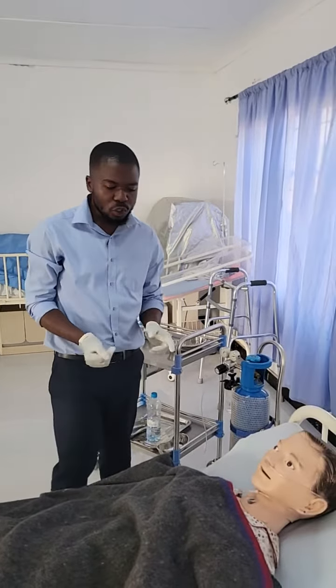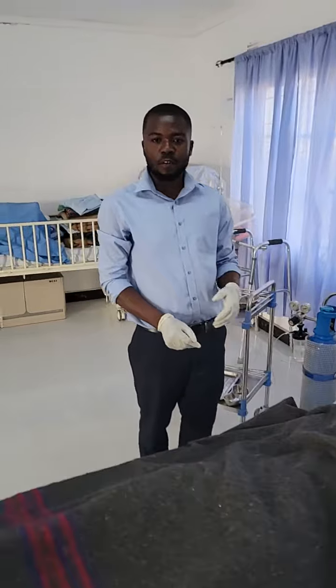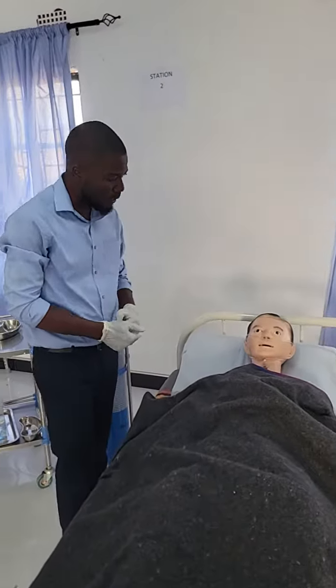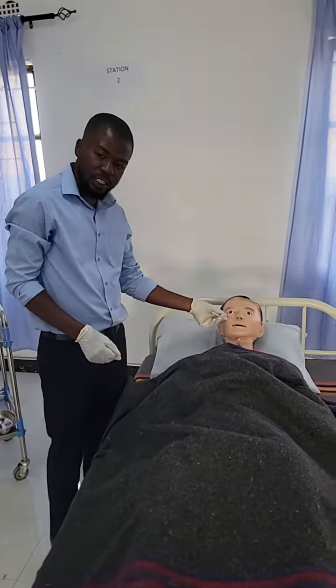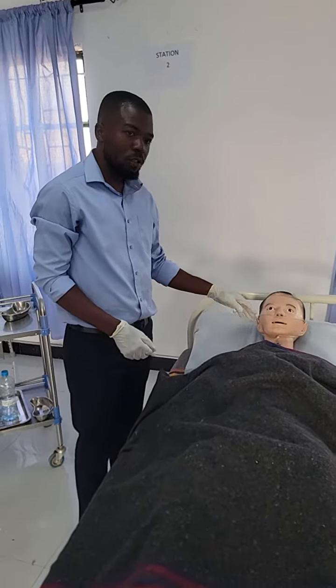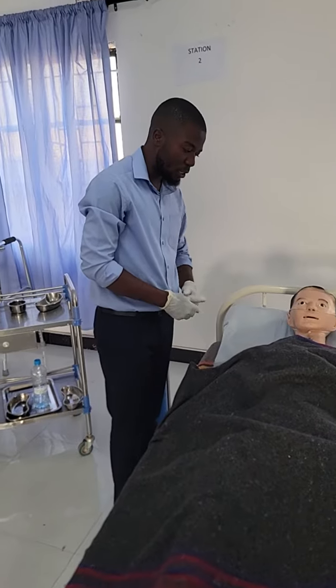The next thing you do is to give IEC. You finish all the procedures by giving IEC. So you say, thank you for allowing me to do this procedure. Make sure you don't disconnect the nasal prongs, because once you disconnect, you are going to have difficulties in breathing. If you find difficulty to breathe, you can simply call upon me and I'll be able to assist you.